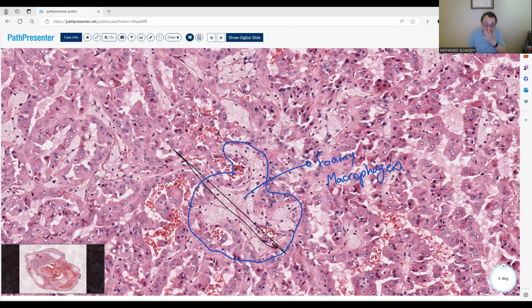It makes sense absolutely. But I'm just telling you that these islands of cells in between with the papillary architecture make it more towards the classic papillary RCC, not the clear cell papillary RCC. And honestly, these cells don't look blue at all. They look as if they are pinkish or clear somehow. Exactly, I agree with you. It's absolutely fine, of course.